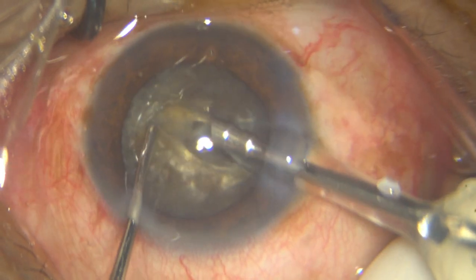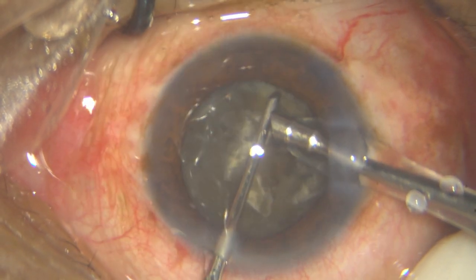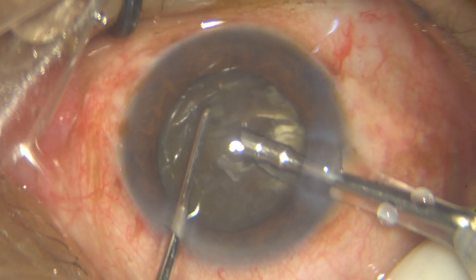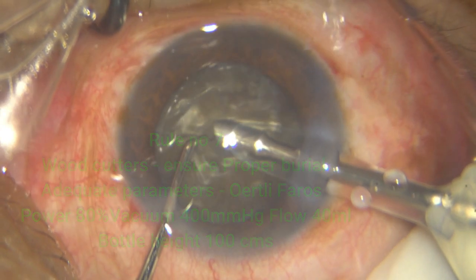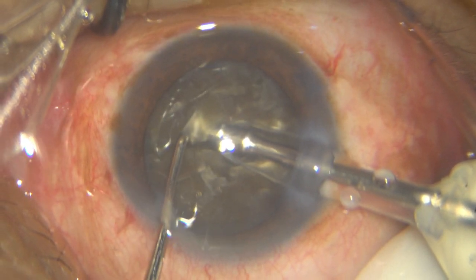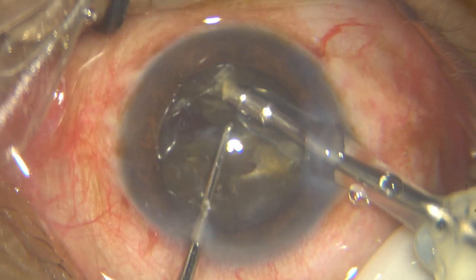Do not make lamellar chops. You will be in a lot of trouble if you make lamellar chops. And rotate the nucleus 180 degrees. Okay, there are a lot of techniques to break up the nucleus. I am showing you the woodcutter's technique. Those are my parameters that you just saw. I rotated it 180 degrees and I am trying to break right up to the backbone.